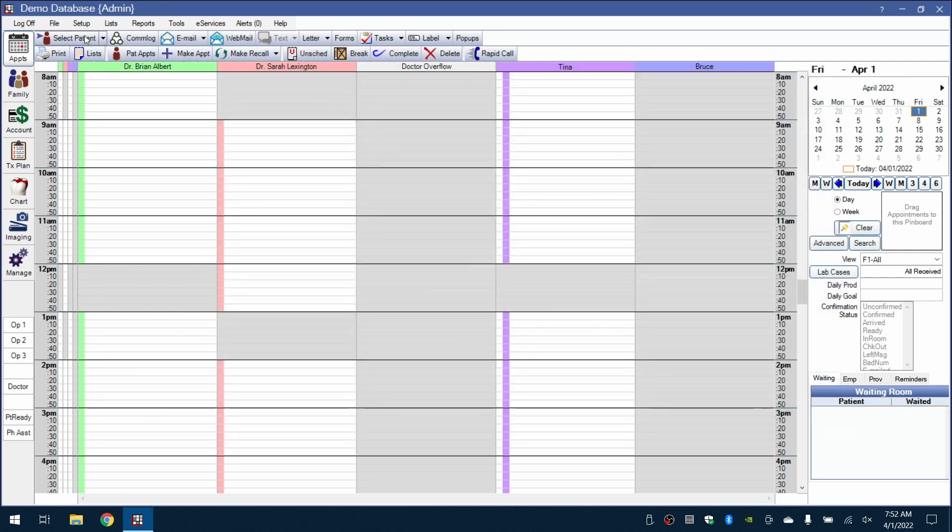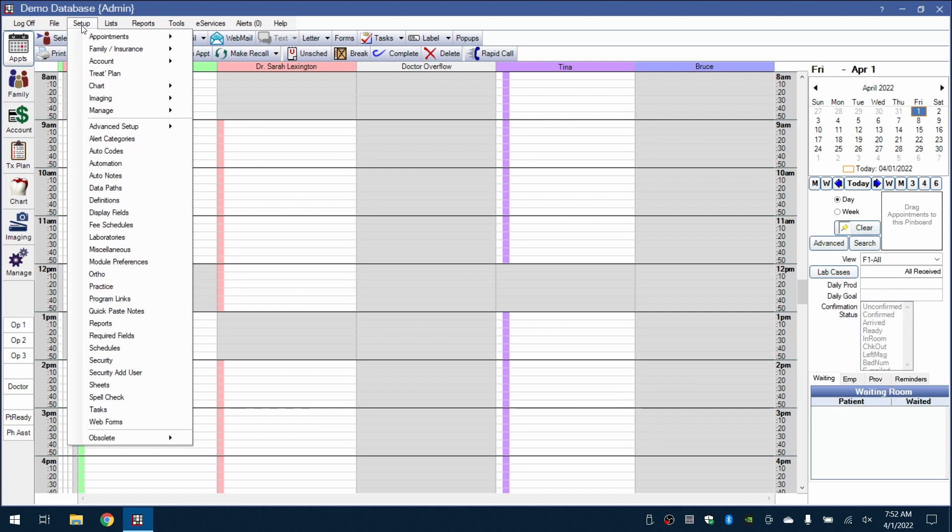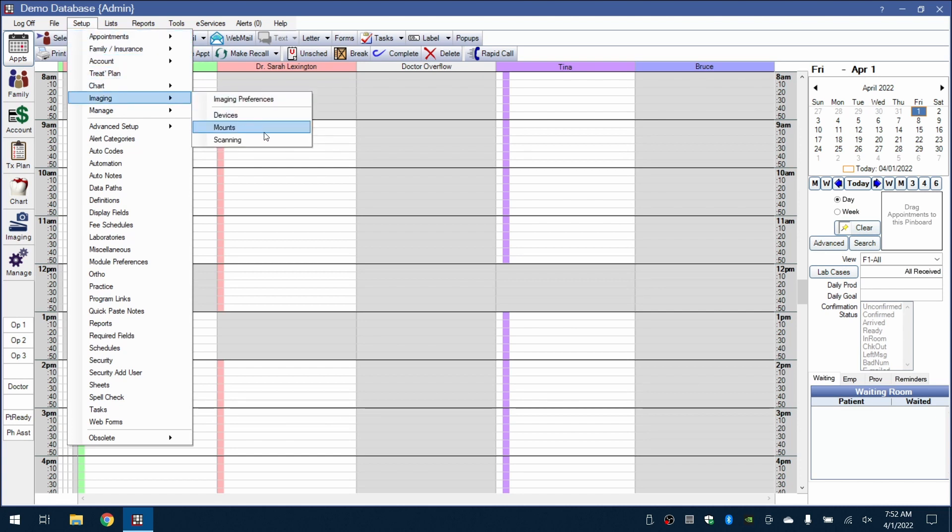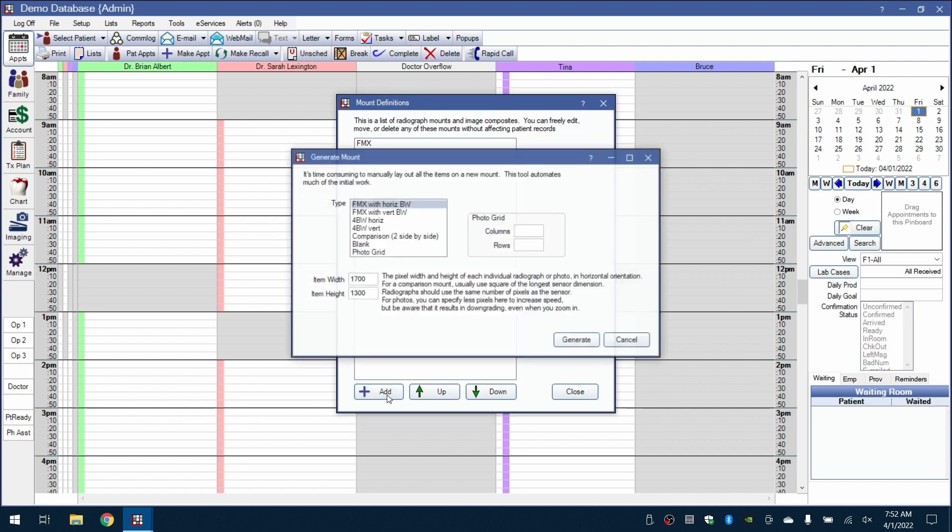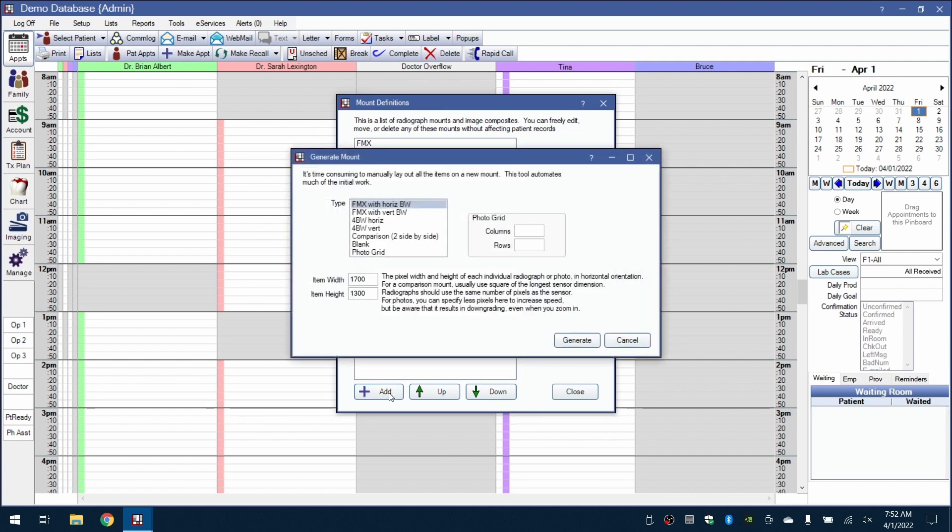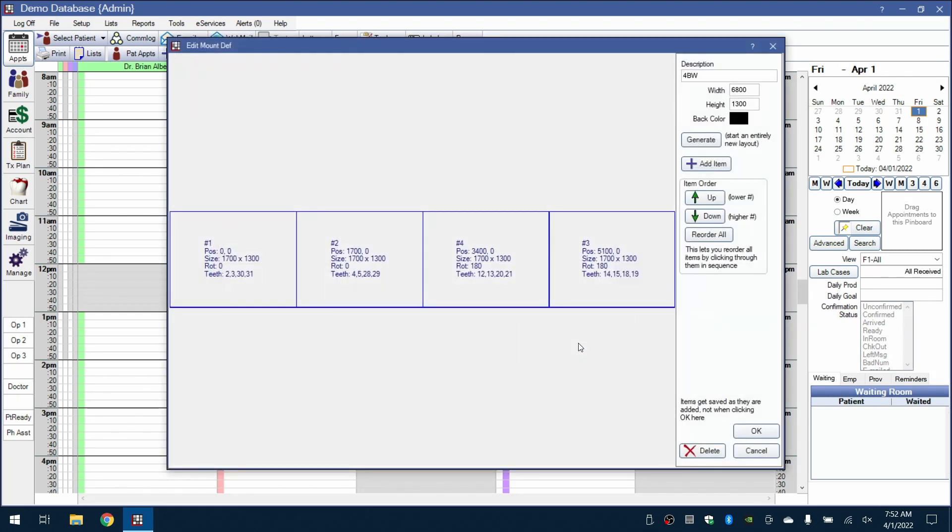Let's set up a four-bite-wing series. Under Setup and Imaging, we'll then go to Mounts. We'll go to Add at the bottom, and then select the four-bite-wing horizontal series and Generate.